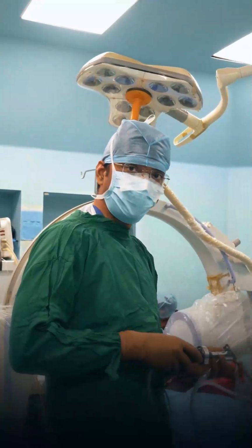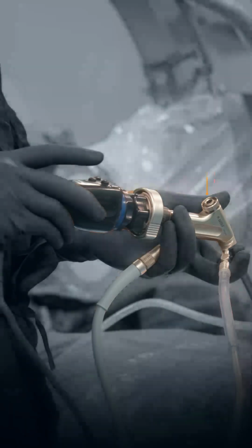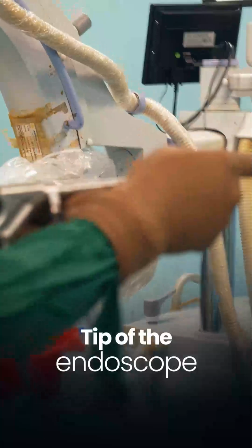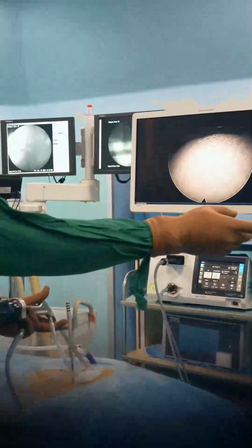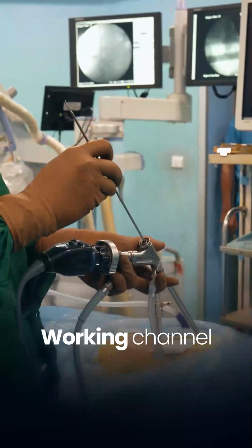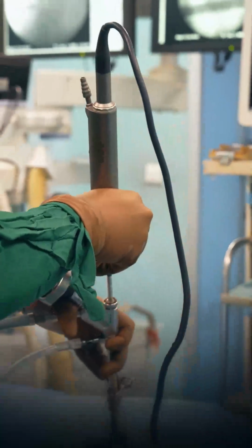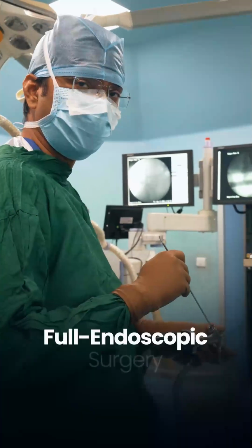So this instrument is known as the endoscope. This is the camera attached here. So all the inside view I can see through this lens. The lens is at the tip of the endoscope. Like this I can see all the inside view during surgery. And there is a working channel also. So I can insert all the working instruments through this endoscope. So simultaneously I can see inside and I can operate. That's why it is monoportal endoscopic spine surgery, otherwise known as full endoscopic spine surgery.